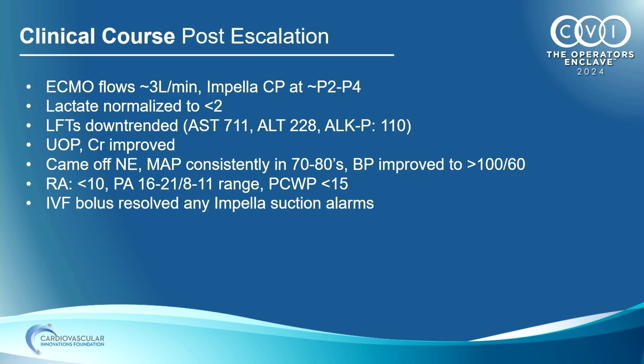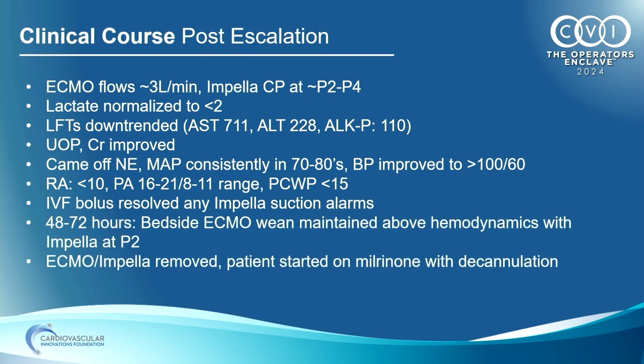Impella suction alarms were starting to become an issue. So this is where we started giving fluid boluses to help modulate that preload, so we could have no suction alarms and not run into hemolysis, et cetera, with the Impella.